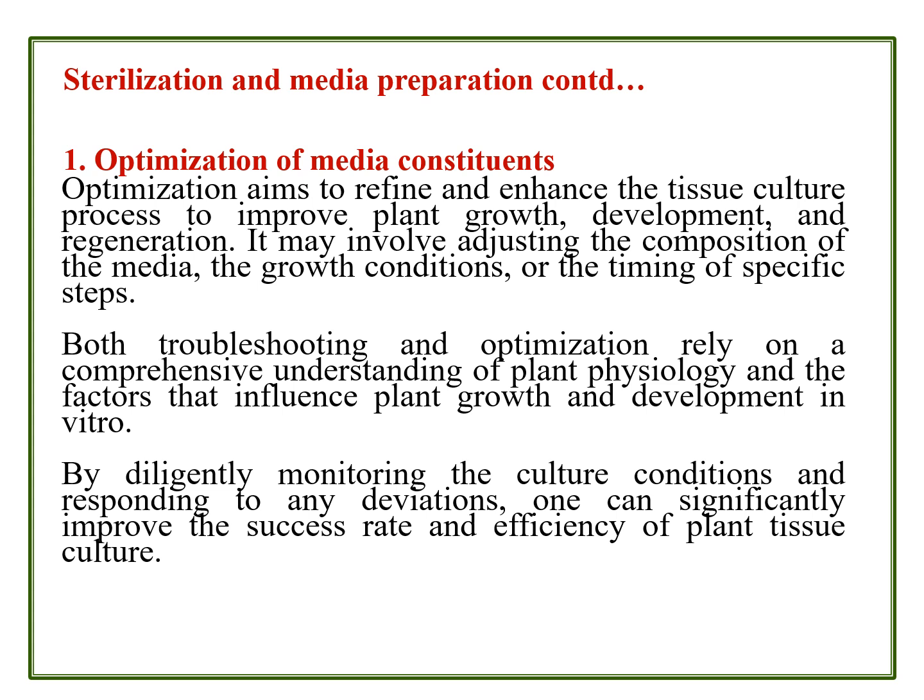Let us see the media constituents in detail. Generally, the media is prepared with the major and minor elements for our convenience. Murashige and Skoog, both scientists, formulated both the micro and macro elements, categorized into five sectors, that is MS1, MS2, MS3, MS4, MS5.